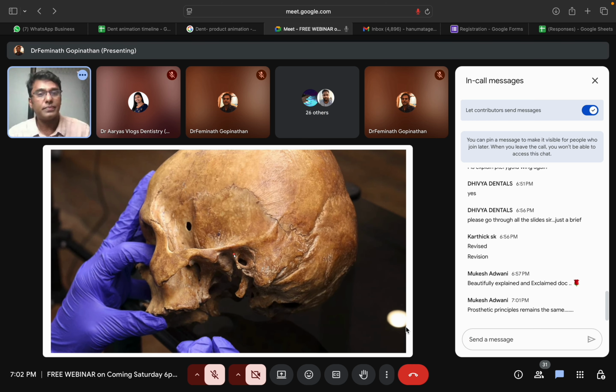So there it has to be placed properly. In the skull, we can see this is the lateral pterygoid plate and this is the medial pterygoid plate. Pterygoid implants are directed from the tuberosity region, then angle backward, engaging the pterygoid process of the sphenoid bone, which is a safe area where no blood vessels are found and all the muscles are attached to the lateral pterygoid plate.